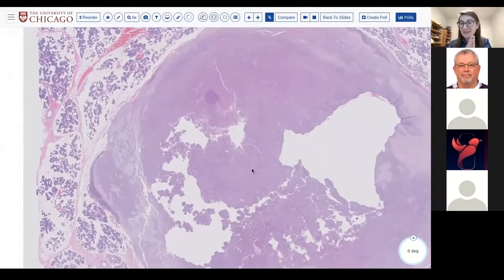if you diagnose carcinoma in this context, you must diagnose it as in situ or intracapsular. And therefore, the clinical behavior is basically the same as a benign pleomorphic adenoma. So honestly, I don't think this is epithelial myoepithelial carcinoma ex PA because it does not have an invasive component. We know that the morphology can be overlapping, and it's overall very bland or very low grade. So in this case, I would not diagnose an invasive carcinoma ex PA. I probably would not even diagnose an in situ or an intracapsular carcinoma ex PA. If you think that's what it is, again, I would be very cautious and explain that this is still a circumscribed neoplasm and indolent behavior is still expected.